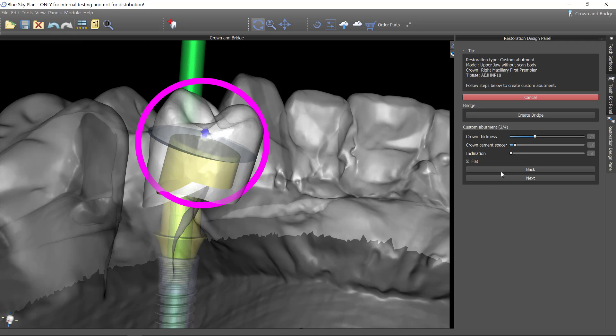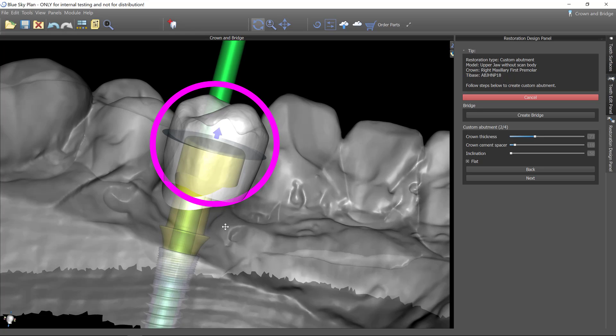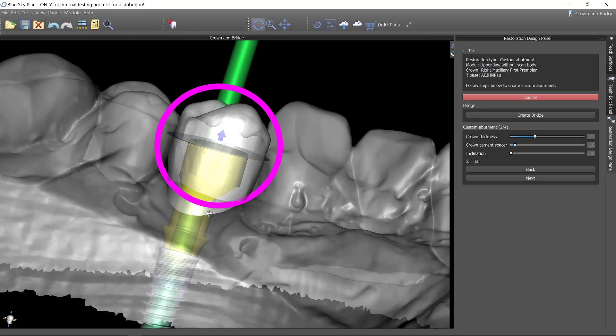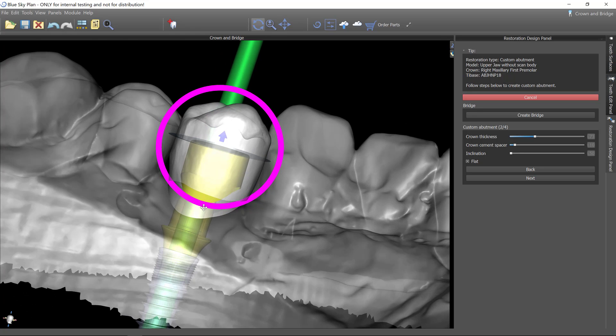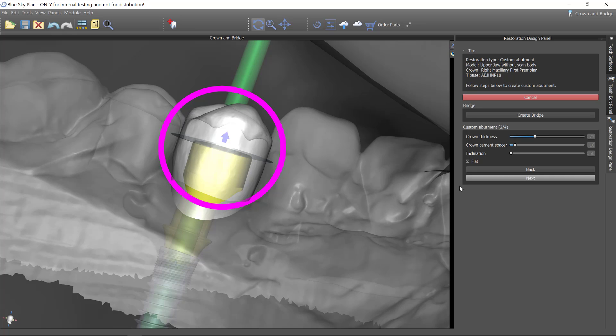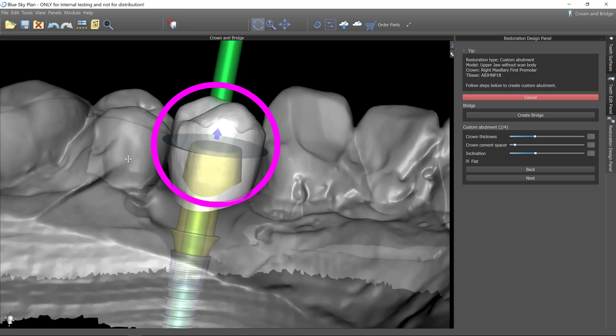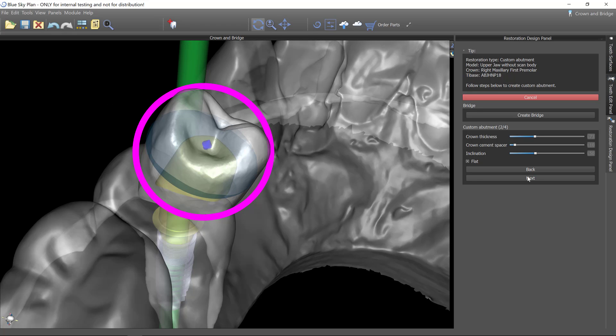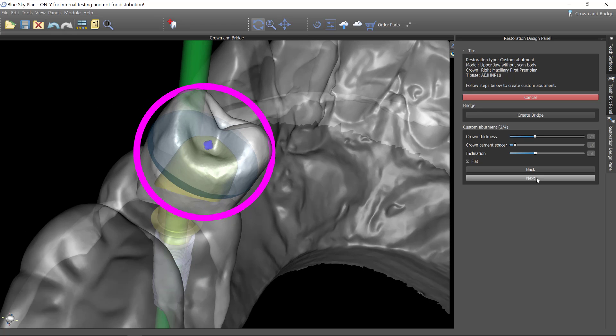And I can create what amount of cement spacer I want. I can also alter the abutment inclination. So if you look at it from this way and I increase the inclination, do you see how this tapered this more? And so I like to taper it just a little bit more than what it defaults to. So now I'll click next.